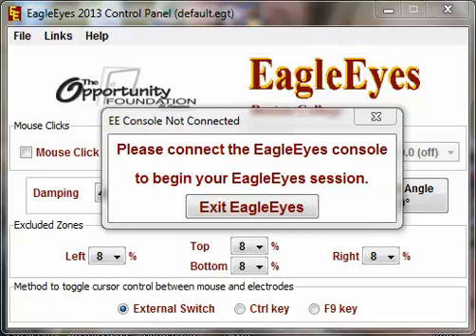Welcome to the software element of the EagleEyes training. We're going to go over all the settings in the EagleEyes software. Recommended computer equipment is a standard desktop or notebook computer with Windows XP or higher, or a Mac. An open USB port and an internet connection are required.